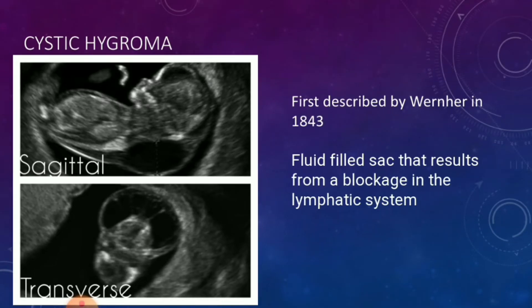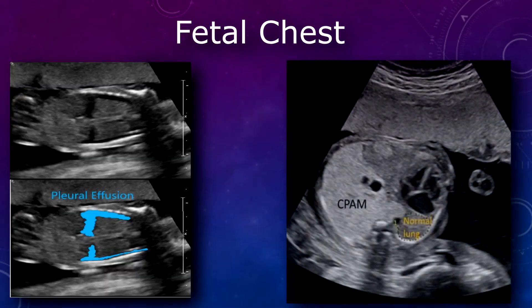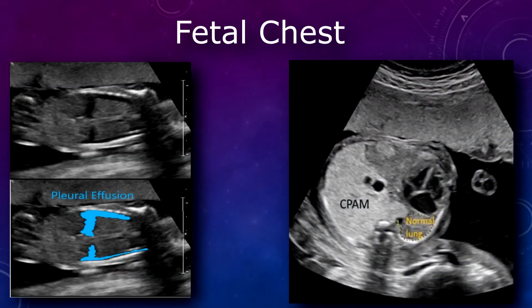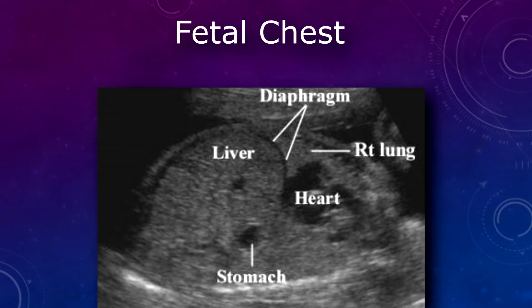From here, you may travel down into the chest. In the chest, you'll be able to see the fetal lungs, which are echogenic bilaterally. This is a good spot to rule out things like pleural effusion, cystic adenomatoid malformation, or pulmonary hypoplasia. In the coronal view, you may see the diaphragm and check for fetal breathing, and also rule out things like diaphragmatic hernia.